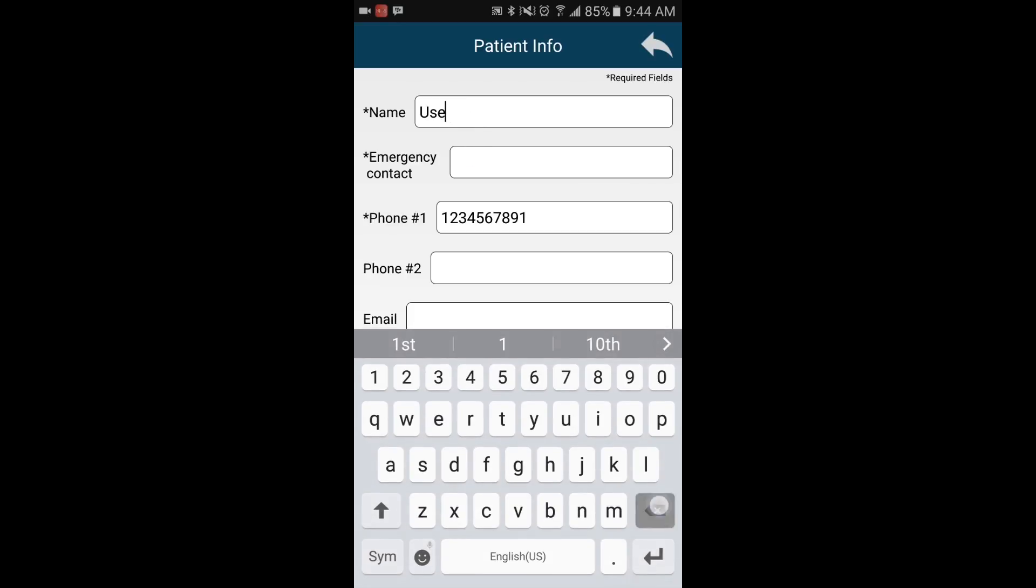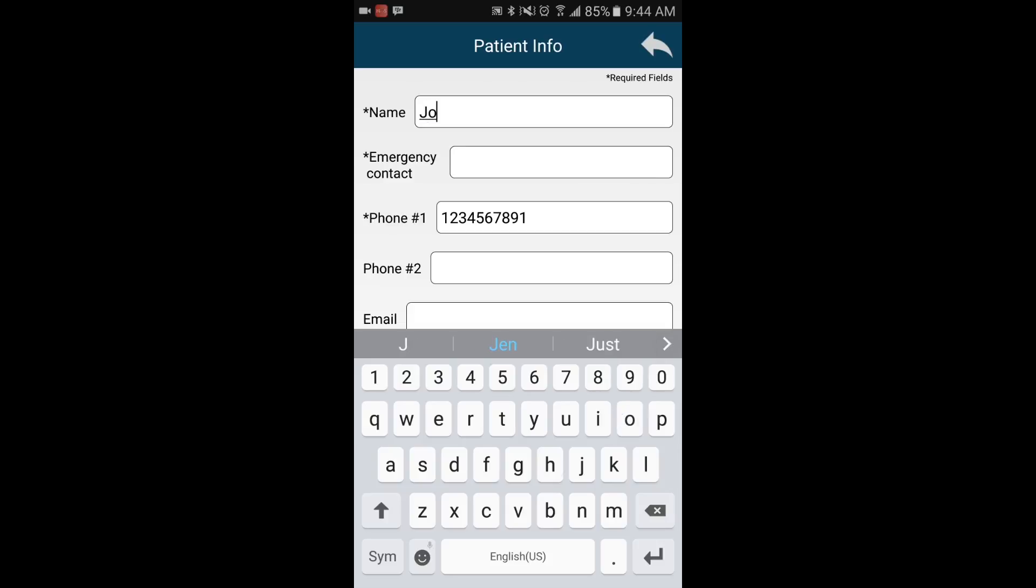Next, put in your information. If there is an asterisk, this means you must include this information in order for the account to be saved.